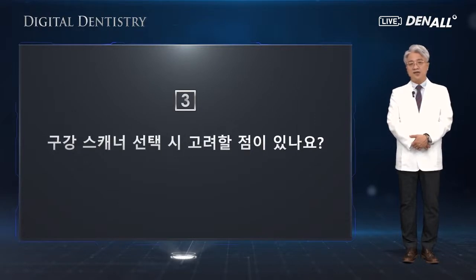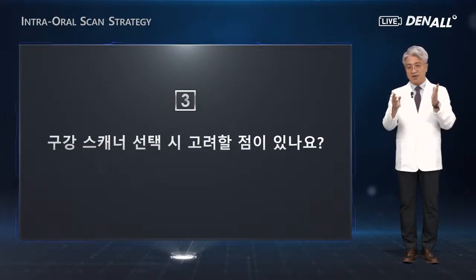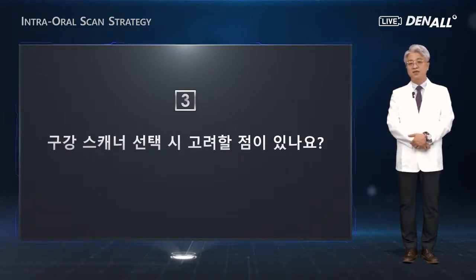Video type precise scanners were not available that much, but many companies upgraded the scanners and video type scanners are available, many of them. And the price range is quite broad, so fitting to your dental office, scanners with an appropriate price and appropriate performance can be chosen.